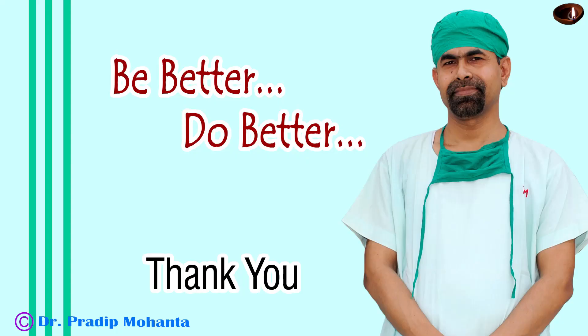Thank you very much for your attention. This is a totally unedited surgery. I hope this video will help you in developing your surgical skills, inspire you to record your surgeries, and upload them to your own YouTube channel.